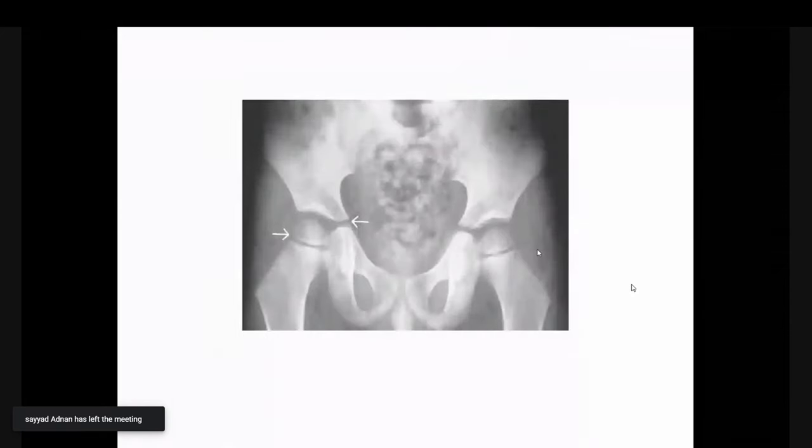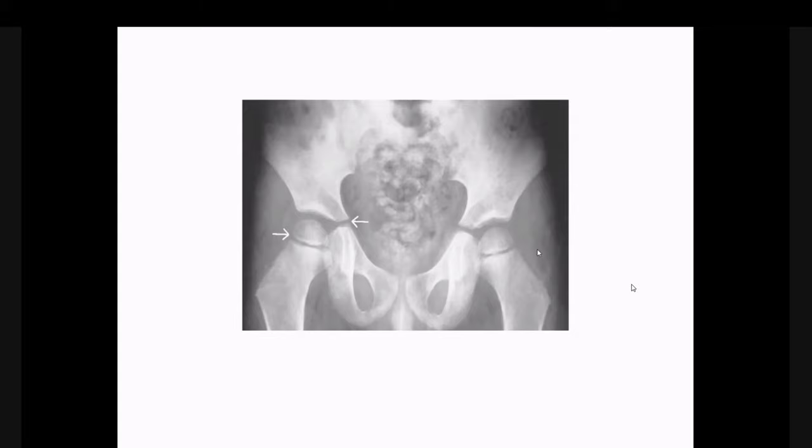So if we are using a mummifying technique or wrapping around the patient at the bedside, then we can have better image quality in the pelvis, the spine, and for chest and abdomen radiography. And when we talk about bony development in the pediatric patient, it is most important to use the immobilization device, because in bony development, it does not happen that we expose only one side of the patient.